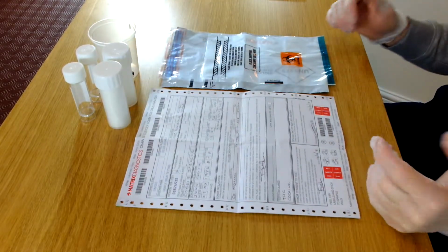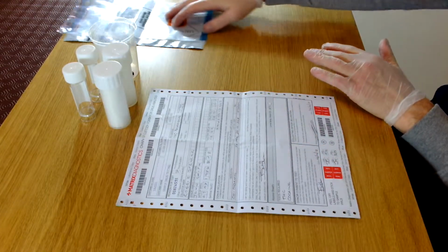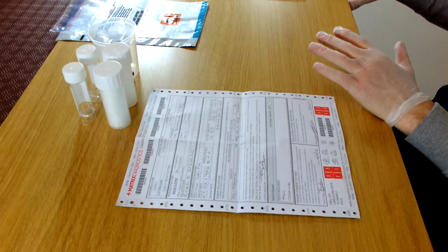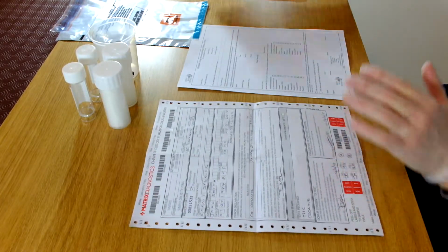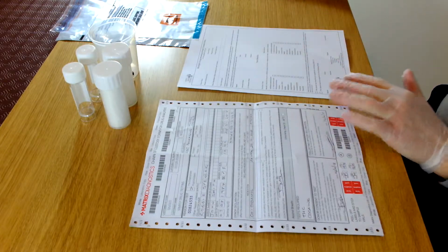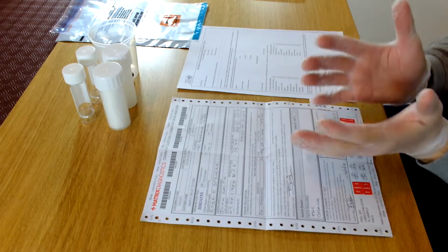So the first thing we have to do is to fill out the chain of custody form. So if we take that first, I'll just slide this to one side. What we do here is take our initial donor consent form, the same form that we filled out when we did the first line test, and we start to transport some of the information from this form onto this.